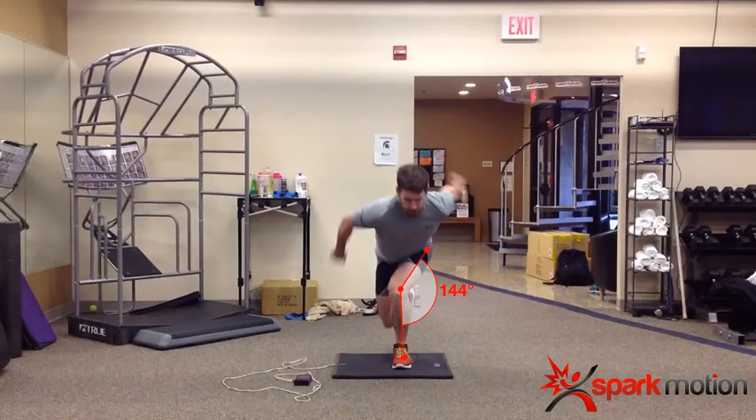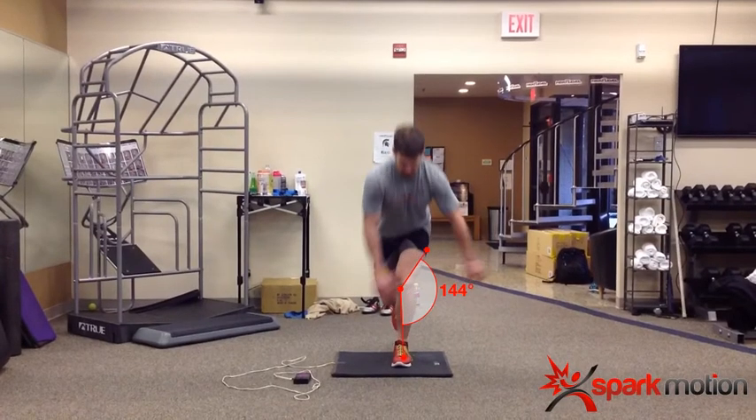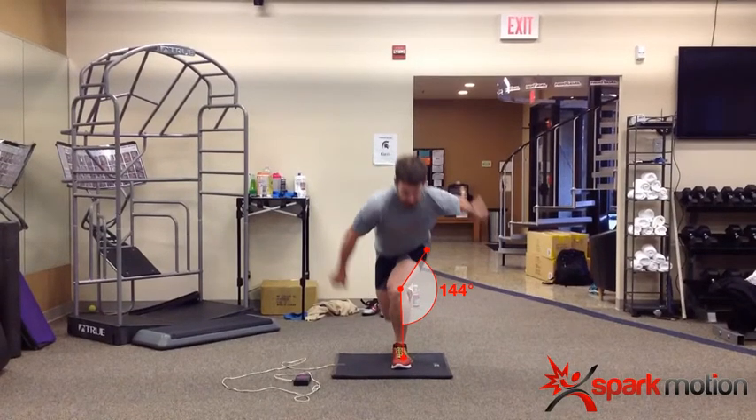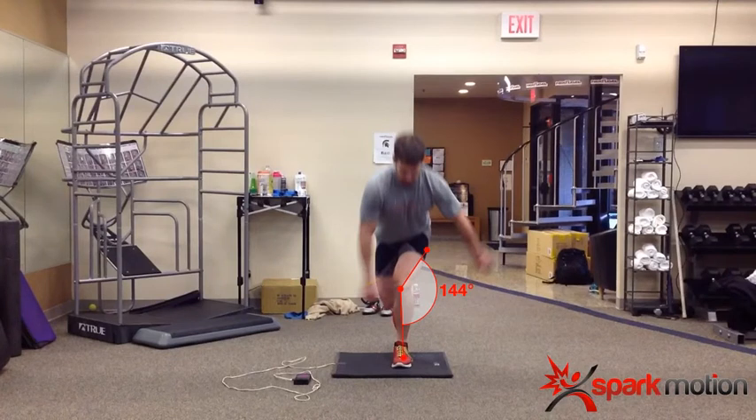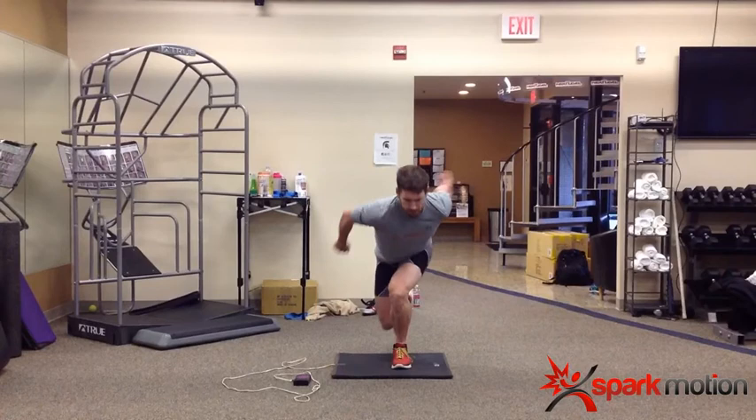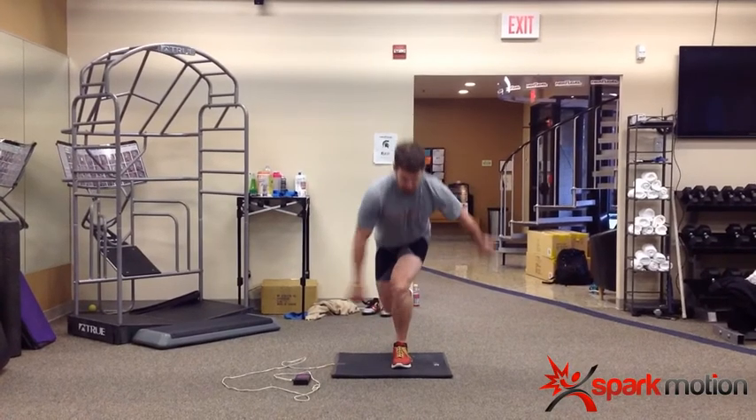We can assess a specific joint angle at a specific point in time at this transition point where he's going into the load and transitioning coming out of the load. That's another drawing feature that can be used. Another tool is simply frame-by-frame — we can break that down and go frame-by-frame to look at what's happening and what kind of chain reaction is going on through the body.